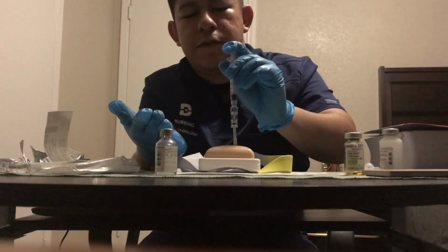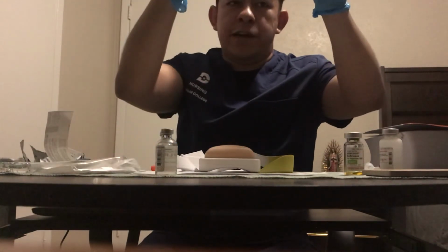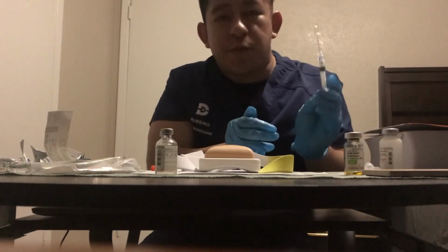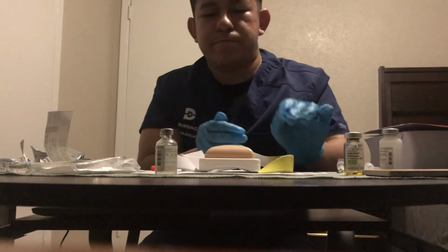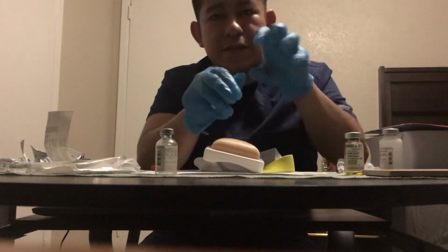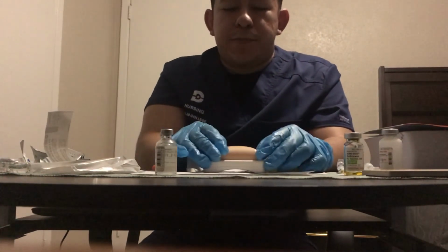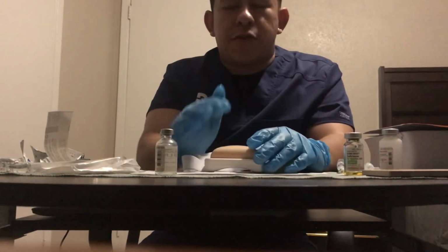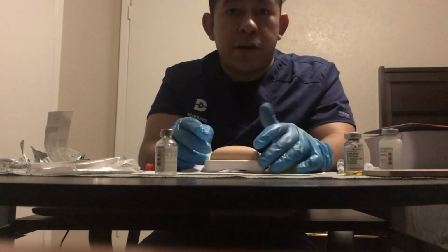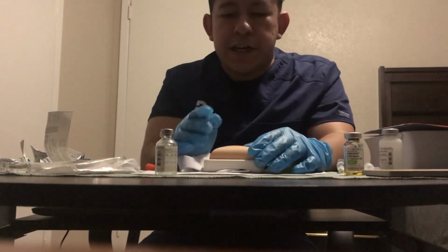And once you have given all of the medication, you lift up the needle and also your hand, and you immediately activate the safety, and you put this in the sharps container. And so using the Z-track method helps trap the liquid so it doesn't seep out after you take the needle out. And then afterwards, you see how well the patient is doing, how they tolerated it. See if they're not bleeding or if they have any immediate reactions.